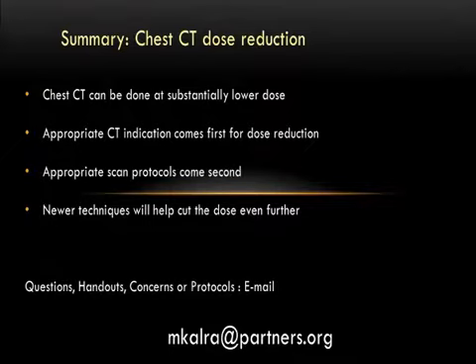I was encouraged to see that you are using different kVPs for different size patients, because at our institution some of our scanners can't scan at 100 kVP, and our radiologists wanted to read everything at the same kVP, so we're doing 120 for everything. So hopefully I can bring this back to them and say, well, other folks are doing it, certainly. Certainly it's possible, but maybe they can't do what you can do there. But the question is, are there any issues that you notice reading the chest if they're done at different kVPs?